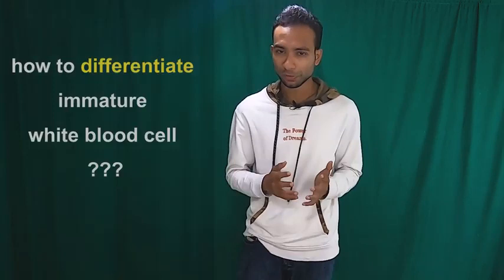Myeloblast. The first committed stem cell of granulocytes is myeloblast. Usually it is spherical and about 10 to 18 micrometer in size. Nuclear to cytoplasm ratio is very high.